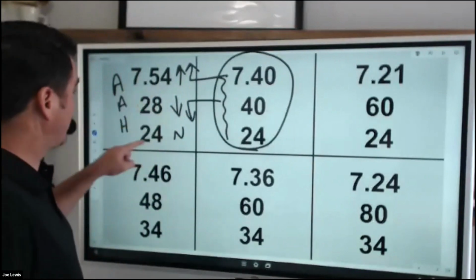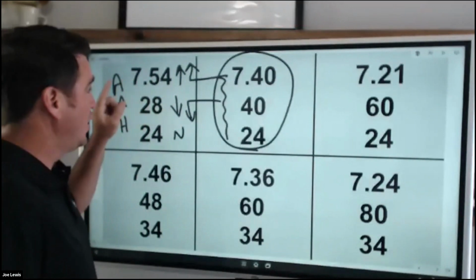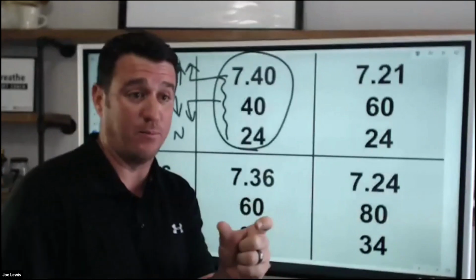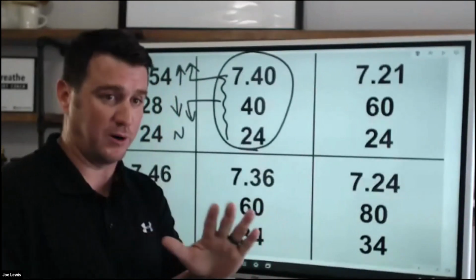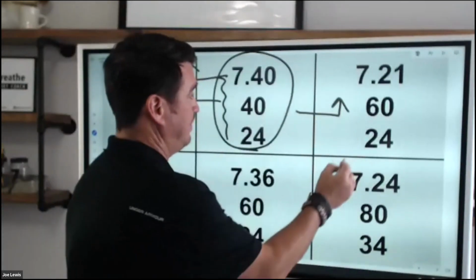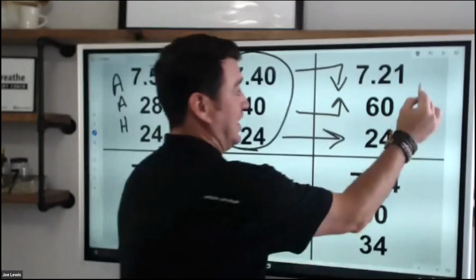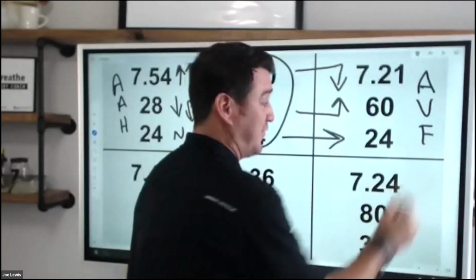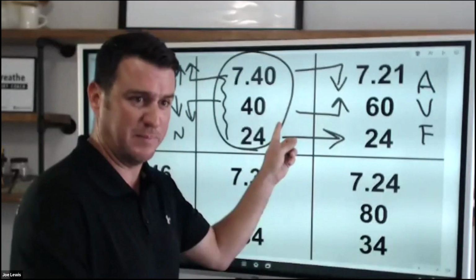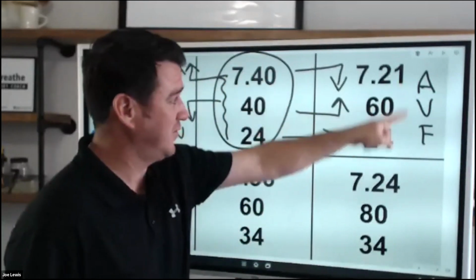Now, when we look at this from our standard ABG interpretations, again, we call this uncompensated respiratory alkalosis. The word respiratory in there tells you it's a problem with the CO2. Perfect, got it. Let's slide over here. CO2 goes up, pH goes down, bicarb stays the same. This is acute ventilatory failure, superimposed on normal, right? We don't have to say that, but just to make a point here. This is their normal. So we just say acute ventilatory failure.